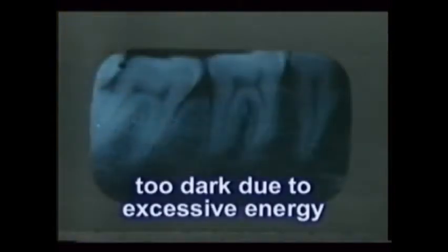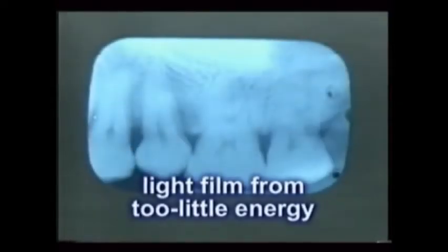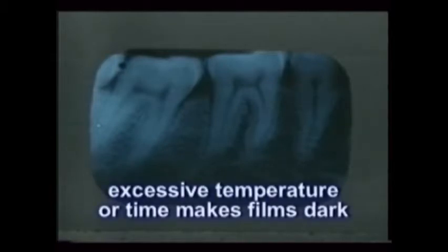Remember that both x-rays and visible light essentially burn the film or make it dark. So if a film is dark, it got excess energy. If a film is light, it didn't get enough energy. And a clear film clearly got no radiation at all. Film darkness can also be due to processing errors — if over-processed due to high temperature or excessive time, the films will also be too dark.